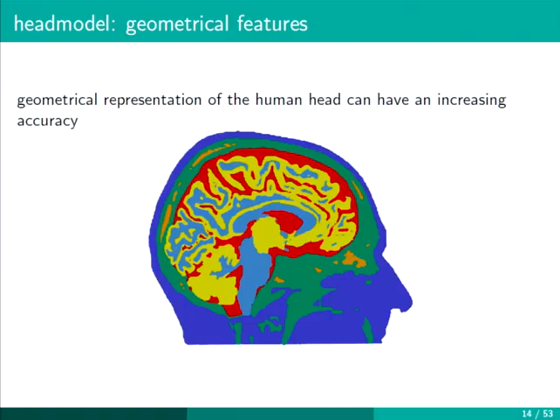The question is what you want to do. I think in our institute we always use a 1 cubic millimeter resolution. This is our default. Yes, usually that's our standard procedure, to use the T2 for the skull segmentation. And then we also usually have DTI data for anisotropy in the white matter.